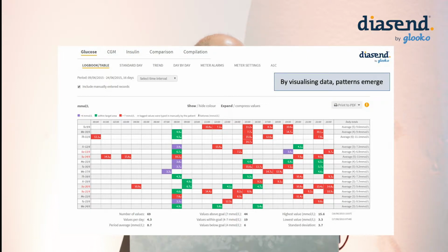It's difficult to base a glucose treatment decision on one number, I would suggest. I think the more data you have, the more data points to inform the picture, the better. And as you all know, HbA1c will tell one part of the story, whereas finger prick real-time numbers tell a very different story. But used together, really invaluable. It's how you use the information. So this is a really useful resource we've used locally.